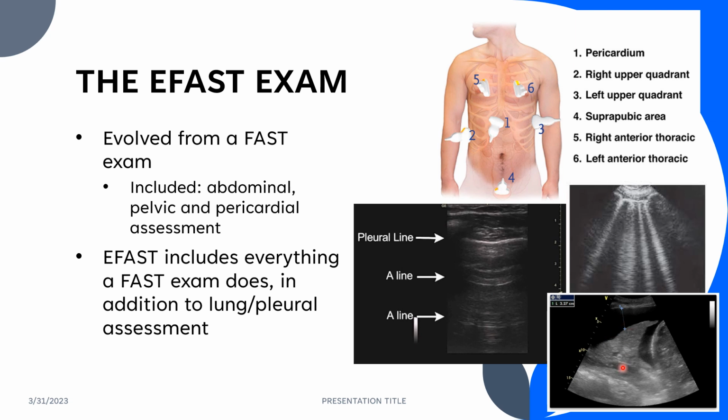That would indicate that we have a pleural effusion or possibly a hemothorax. Now, when blood is early in the bleeding stages with ultrasound, it really appears very similar to just a regular serous fluid, so you'll see it very anechoic like this.